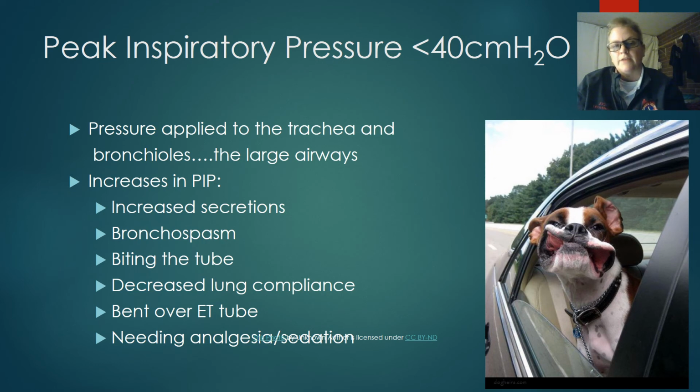Okay, so now let's talk about our PIPs, or our peak inspiratory pressures. This pressure is everything above the alveoli. So the pressure in your trachea, in your bronchioles, in those big airways. Everything above the alveoli. We want to keep that less than 40 centimeters of water pressure.